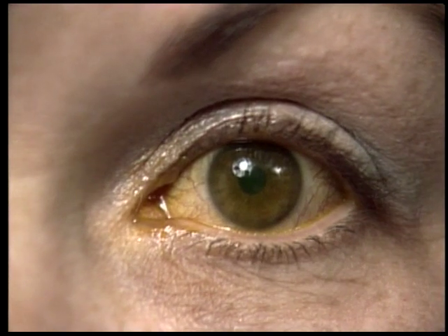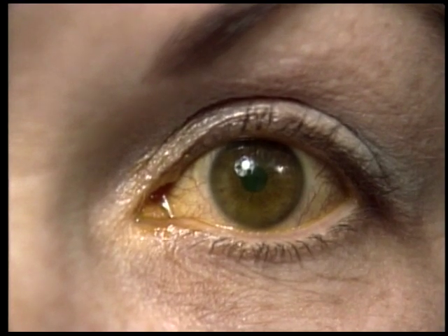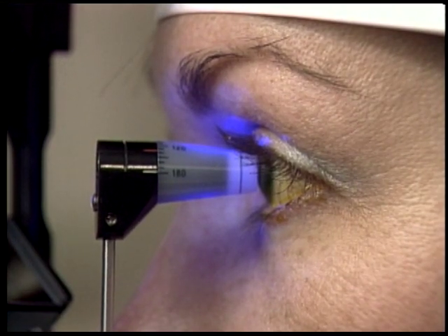An important component of applanation tonometry is the tear film meniscus. The tear film meniscus is stained with fluorescein to allow visualization at the margin of contact between the cornea and biprism. As already noted, the circular area of contact is converted by the prisms into two semicircles called mires, seen here through the slit lamp.